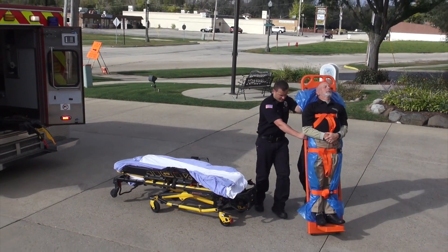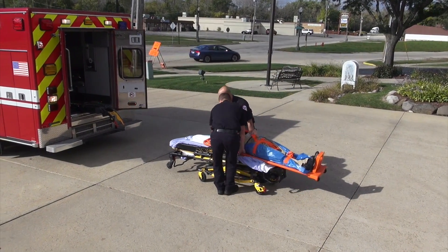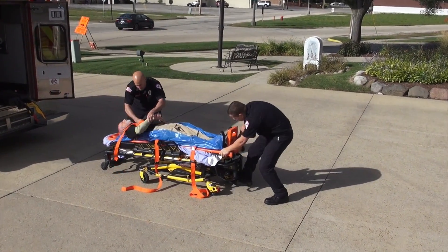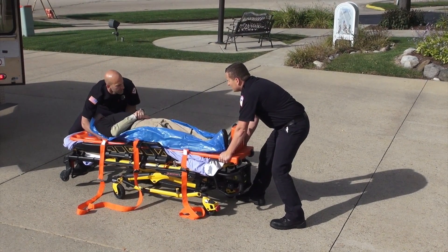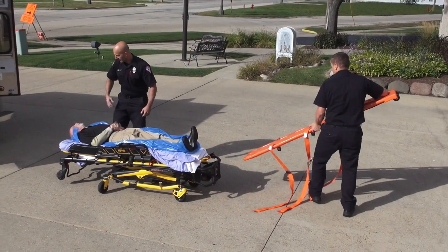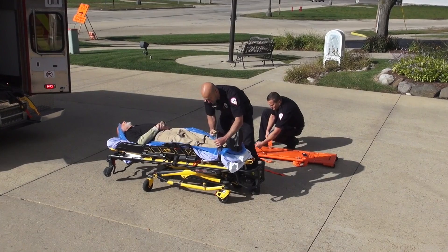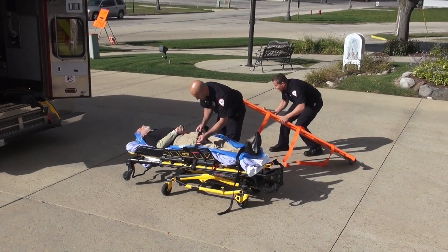When approaching the ambulance, you can quickly and easily transfer the patient from the walkboard to a gurney if the patient's condition allows. A slip sheet allows an easy transition both here and at the hospital. A first responder secures the slip sheet and the patient while another responder gently slides the walkboard out. This allows your walkboard to transport additional patients immediately and helps avoid patient bed sores during transport.